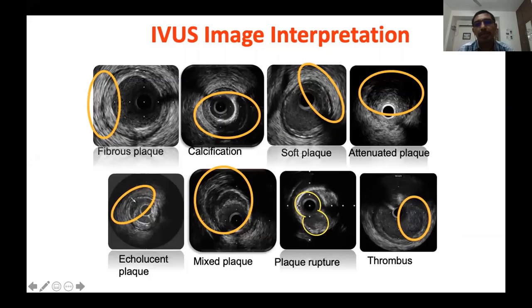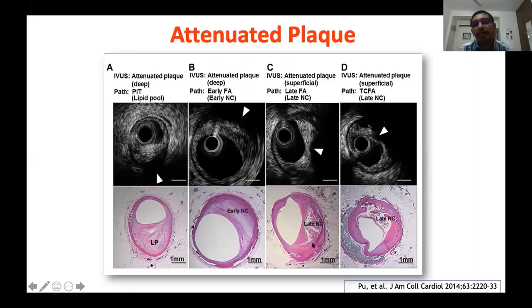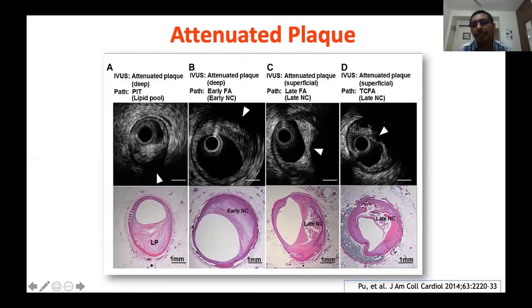More about attenuated plaque: when you have signal attenuation in the deeper part, these usually represent lipid or early necrosis. If the attenuation is superficial, they have advanced necrotic core or thin-cap fibroatheroma — the ones resulting in no reflow. The deeper ones represent either pathological intimal thickening (the earliest atherosclerotic abnormality) or early fibroatheroma. Superficial attenuation is late necrotic core with advanced fibroatheroma. Very superficial with a thin layer is thin-cap fibroatheroma.